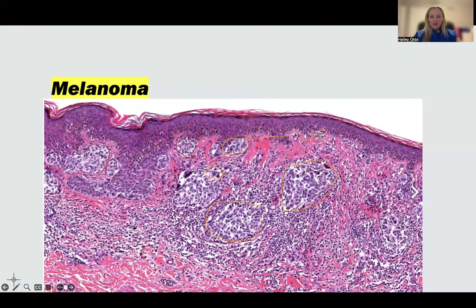And then I'm seeing if there's any melanocytes that are going up. Maybe here there's a couple going up. Sometimes you don't even see the melanocytes nesting. Here, it's kind of hard to say if they're nesting or if they're just hanging out there. You'll just see what we call confluence of melanocytes, where they're just taking over the basal cell layer. And then here, this is probably the deepest nest we have, but the cells aren't smaller than the ones at the dermal epidermal junction, so they don't have that maturation with depth. So those are all things to keep in mind when you're looking at melanocytic lesions.